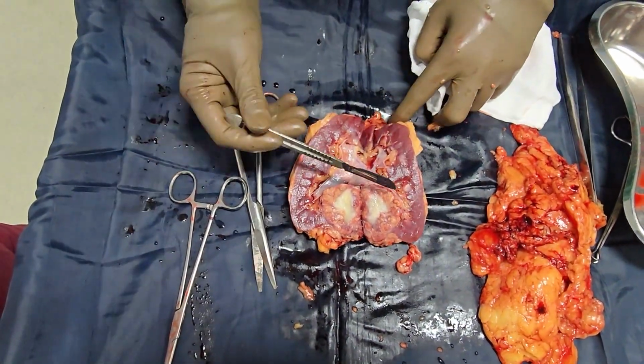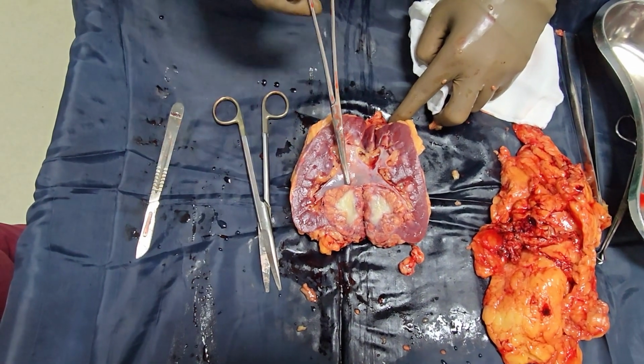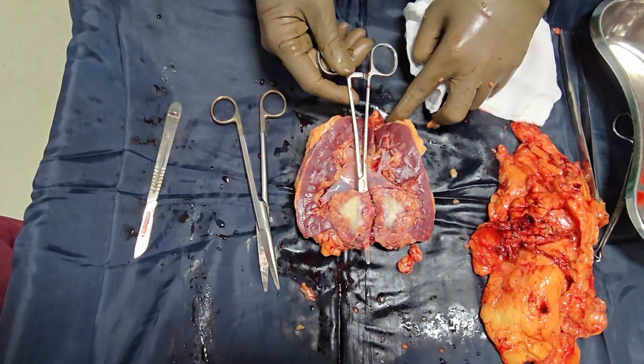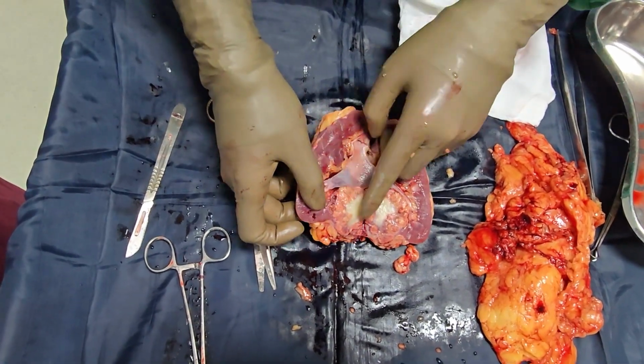This here is the tumor complete. And as I put my artery forceps, you can see the tumor is going, or say, engulfing the ureter.